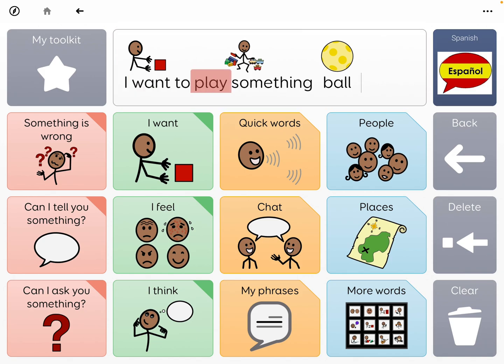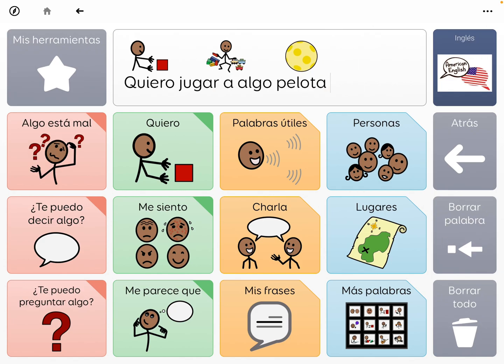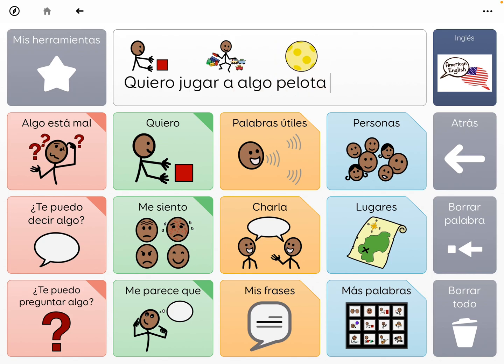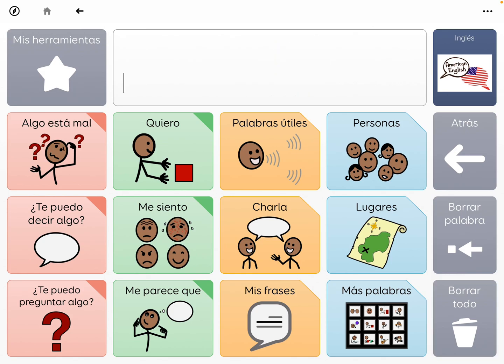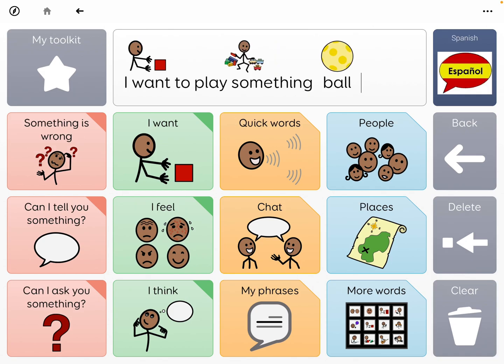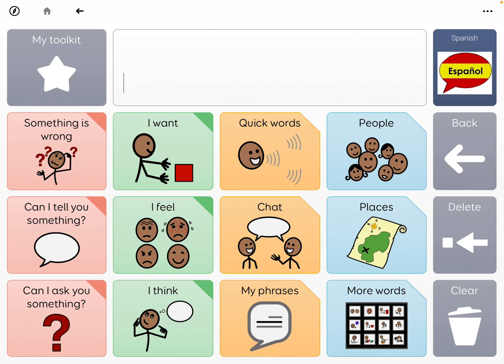So you can at least go back and forth and you don't lose the contents. For example, 'I want to play something, Val' — I'm going to say it in Spanish — it's still over there. 'Quiero jugar a la pelota.' And if I wanted to clear it, I need to clear it in both of those grid sets.